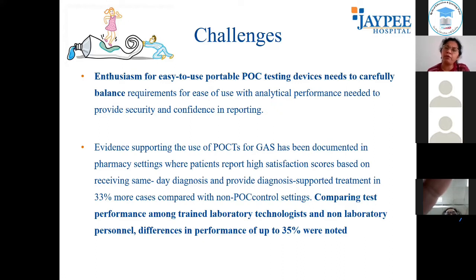He would keep it for 20 minutes. And in the Typhi IgM assay, he would get a lot of positivity. Then when we looked at it, we blamed the kit, that the kit was not good, it was giving a lot of false positivity. Then when we did a root cause analysis for this, we realized that probably the kit was not the problem. The technologist thought that probably 15 minutes and 20 minutes would not make much difference, but it makes a difference. So in POCT testing, lab technologists to be trained, to be conscious, is very important.